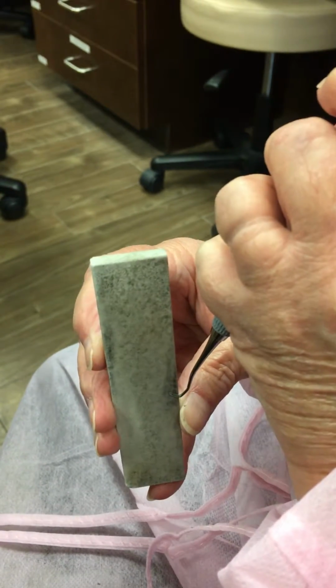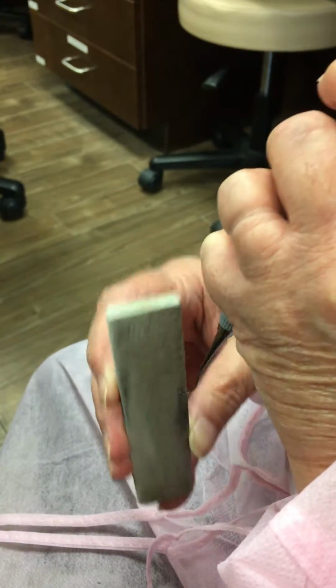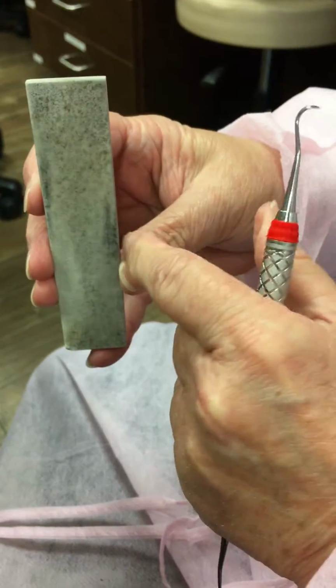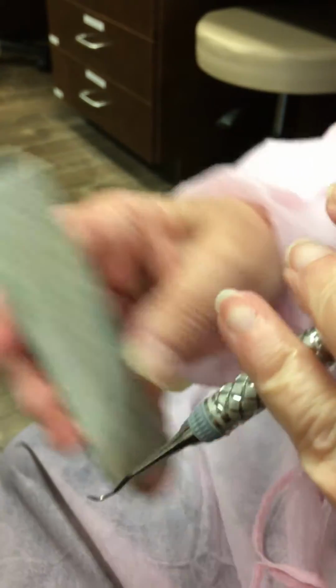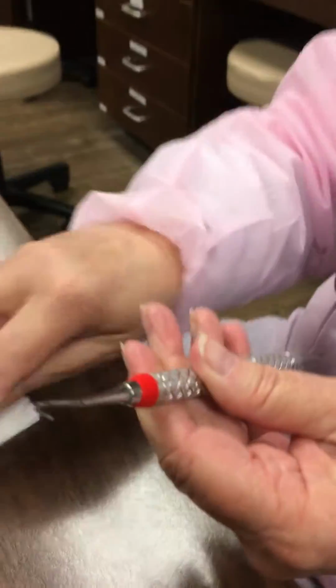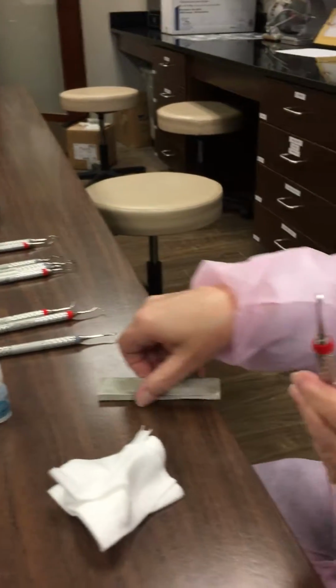The other clue that you're getting close to sharpened is that on your stone you will start to see black marks. That means that metal shavings have been removed from the cutting edge of the instrument. So that was the H5 33. We're going to move to the H6 H7.